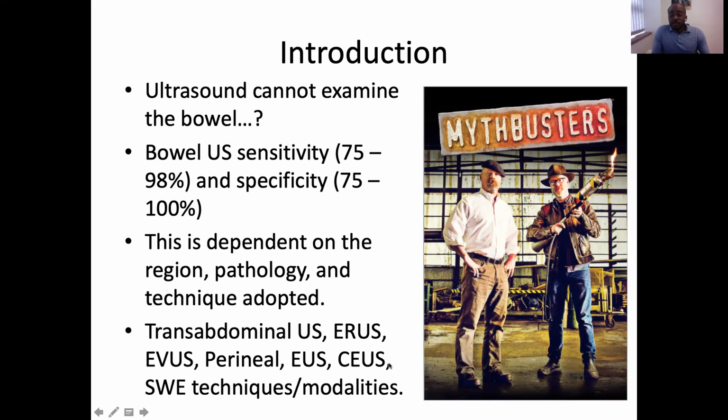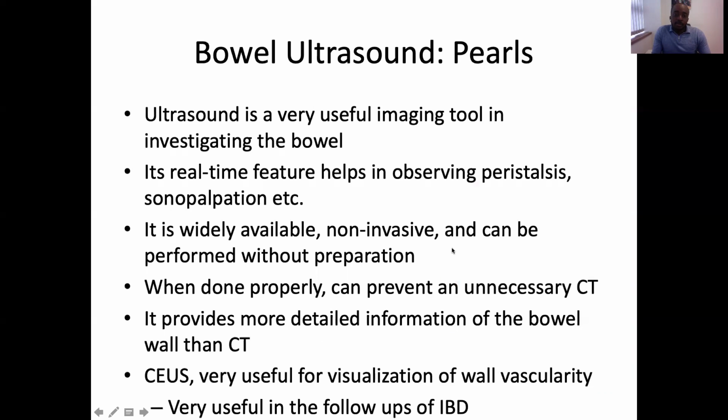So contrast enhanced ultrasound is quite useful in that technique. And also shear wave elastography has been proven to be very useful to increase the sensitivity and specificity of diagnosis of bowel-related pathologies. However, for the purpose of today's lecture, we'll be talking on transabdominal bowel ultrasound.